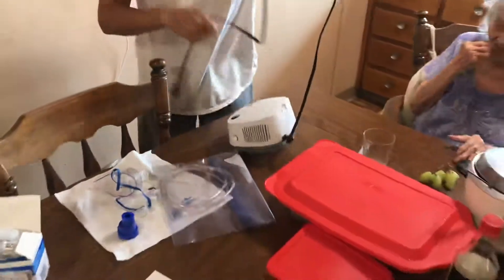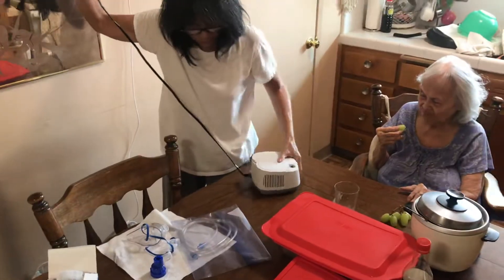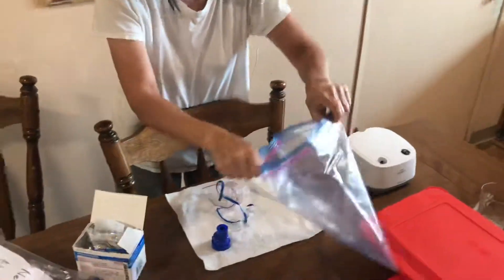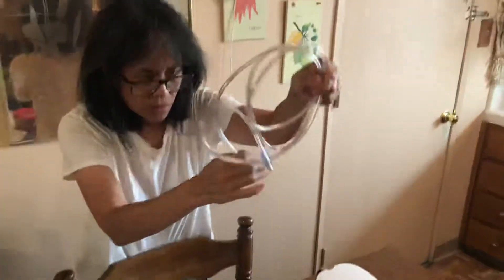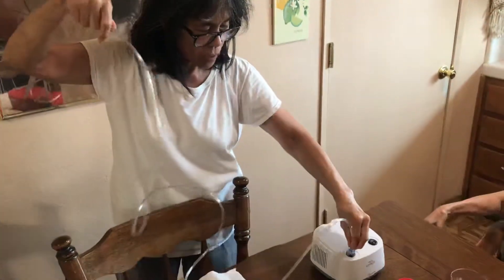This is the nebulizer, which will stay on the dining table. Plug it in. And this is the tube — I attach one end here.